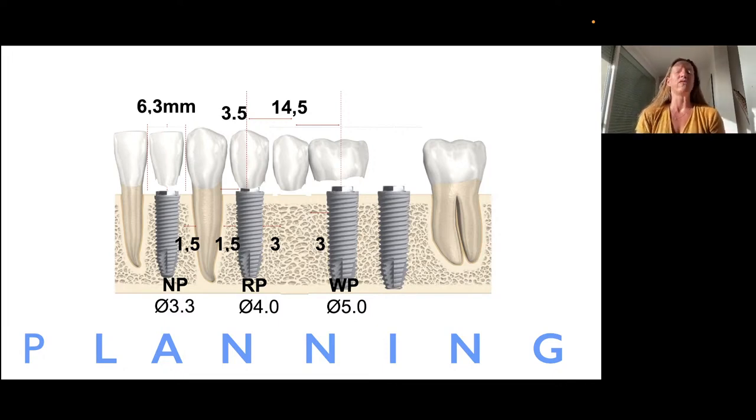Of course, my advice to you is that if you are able to do a scanning, if you are able to work with digital and do a guide, even if it's just a guide for the first drill, you can go and use it, okay?